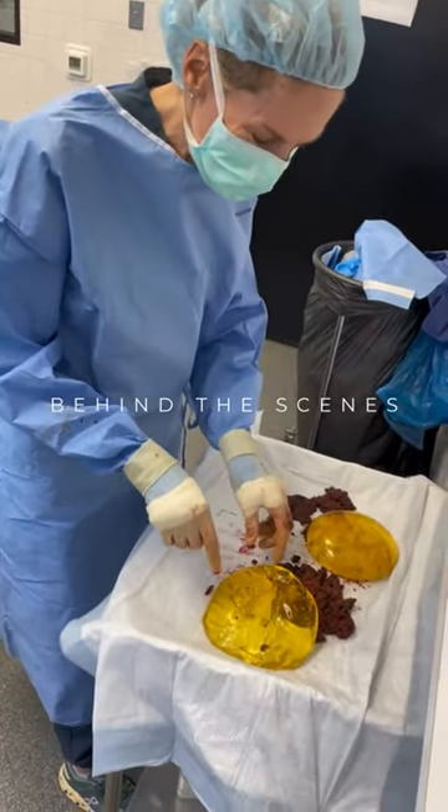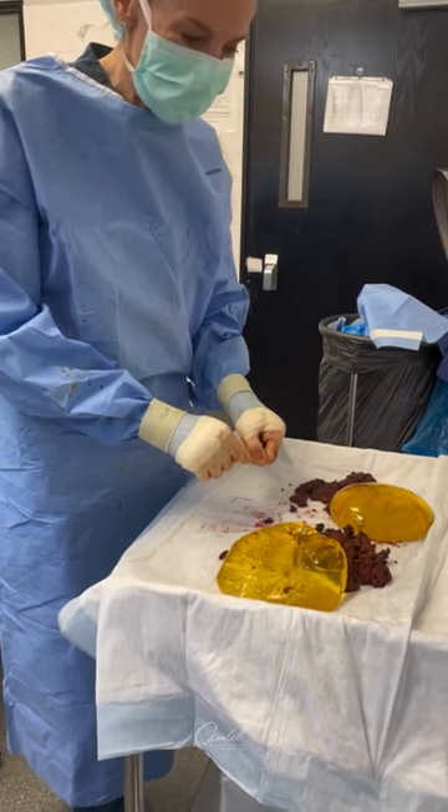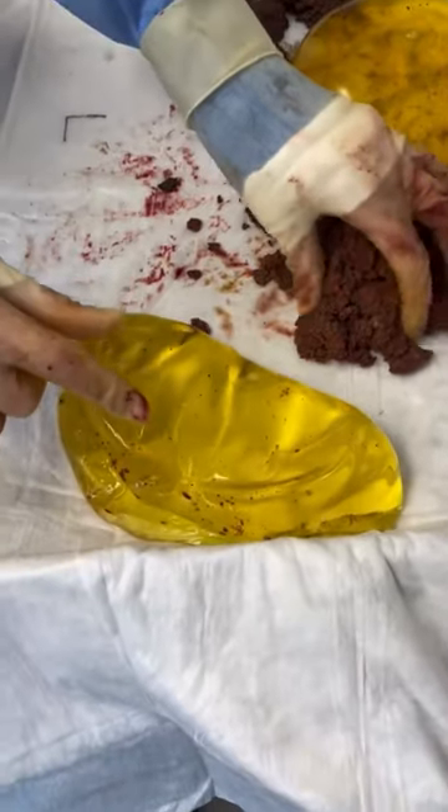The grosser side of plastic surgery. This came out of this patient's capsule. You see it's ruptured. That's not really the problem — the problem is this.